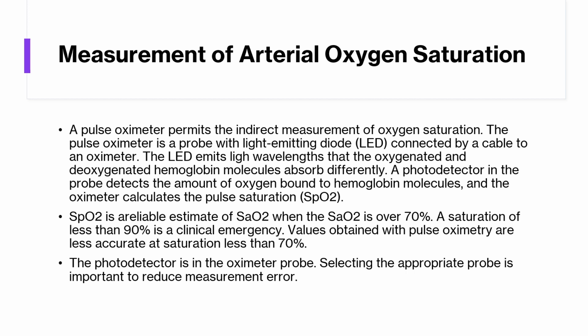You can apply disposable sensory pads to a variety of sites, including the forehead, the bridge of an adult nose, or the sole of an infant's foot. Oxygen saturation measurement using a forehead probe is quicker than finger probes and most accurate in conditions that decrease blood flow. Factors that affect light transmission or peripheral arterial pulsations affect the ability of the photodetector to measure the SpO2 correctly. Awareness of these factors allows accurate interpretation of abnormal pulse saturation measurements.